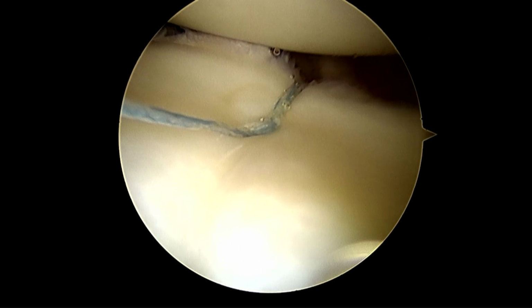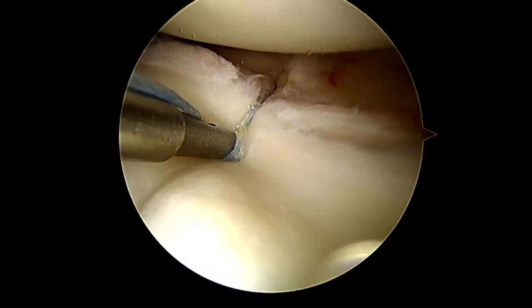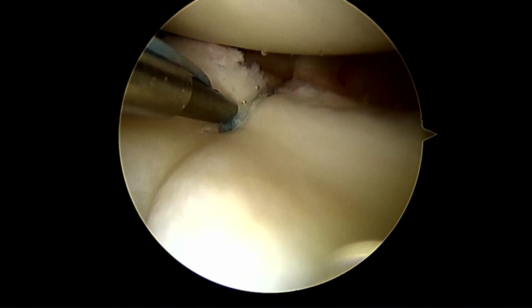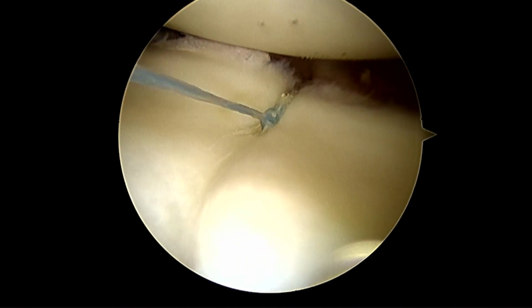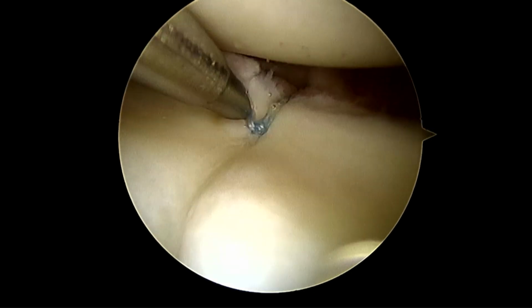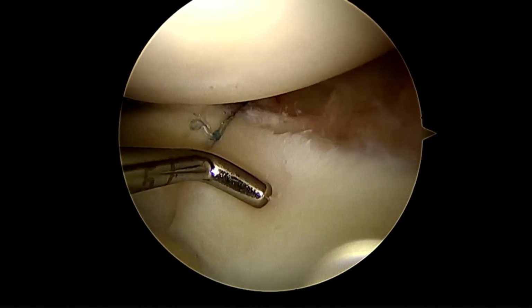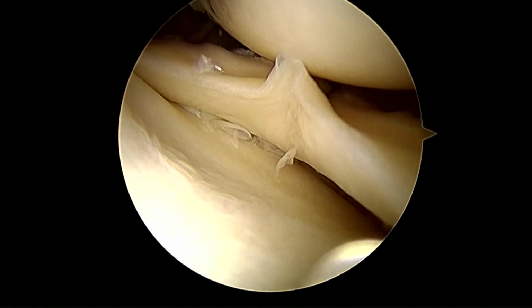Yes. Many times what happens is that after taking these sutures on the superior aspect of the meniscus, it gets elevated. So to compress that, we have to take a bite and fix the meniscus on the inferior part of the meniscus also, so that this elevated part settles down later.